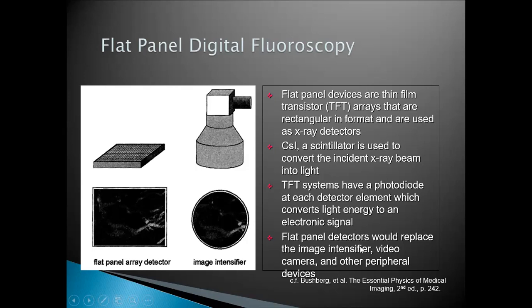Of course, they said it will replace. It is already replacing. This is the second edition of the book. In the third edition, of course, even today we have so many systems that use flat panel detectors. So many fluoroscopy systems that use flat panel detectors. In fact, so many imaging systems are going for flat panel detectors, like so many CT, so many simulators today used in radiotherapy. They use flat panel detectors.